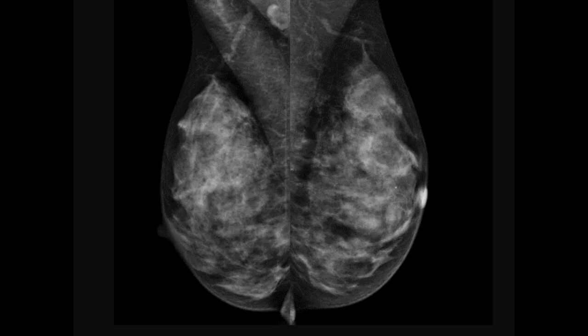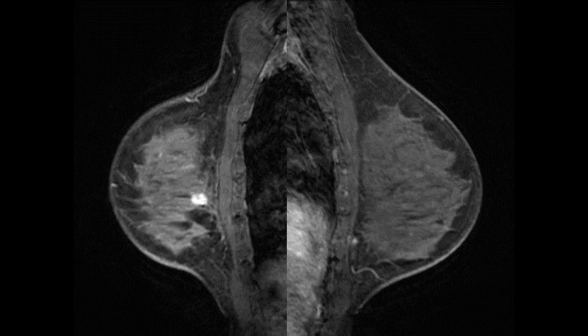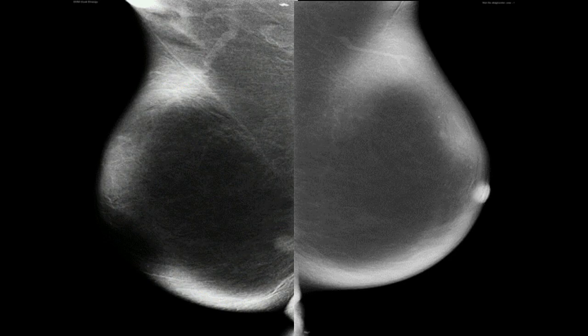I'd like to start with an example. This is one of those run-of-the-mill, heterogeneously dense breasted women with a mammogram that looks completely normal. However, she had an MRI, and you can see that there is an enhancing mass that is completely mammographically occult. And this is her contrast mammogram. This is one of the original units available many years ago.